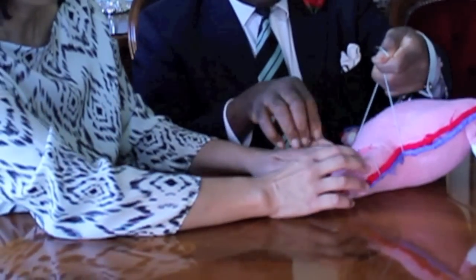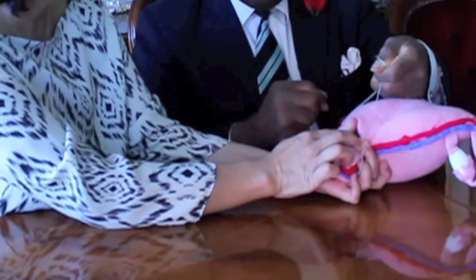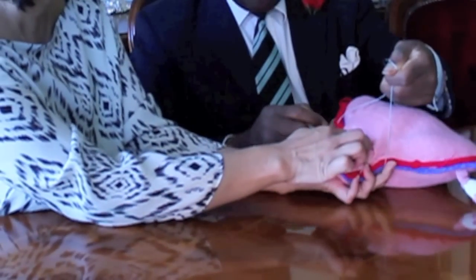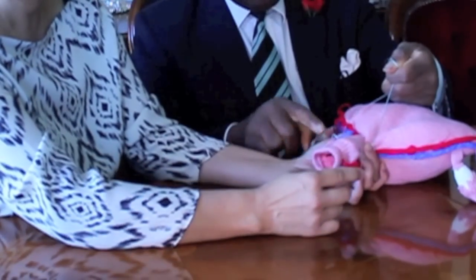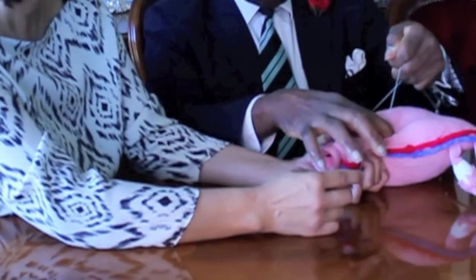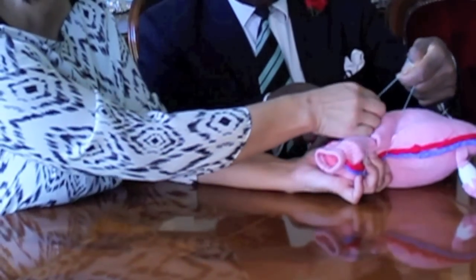The assistant or the surgeon will squeeze or compress the lower segment, whilst the assistant checks that the vagina has been occluded. Whilst doing that, some degree of tension is exerted on the suture materials.